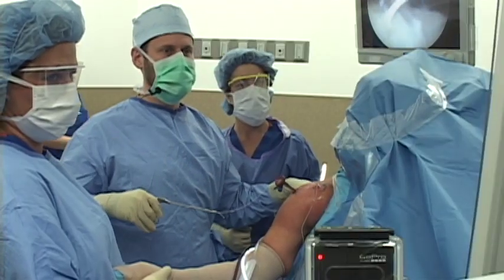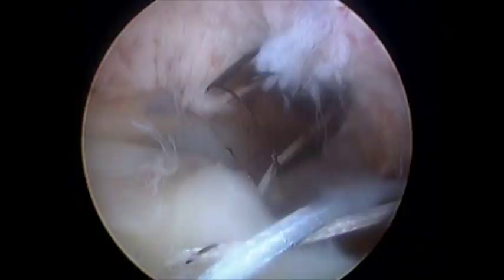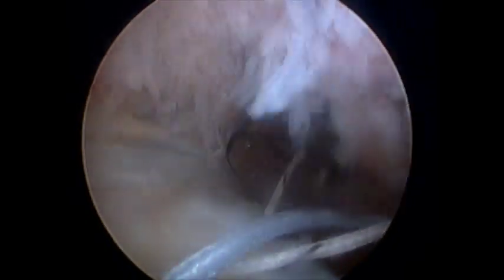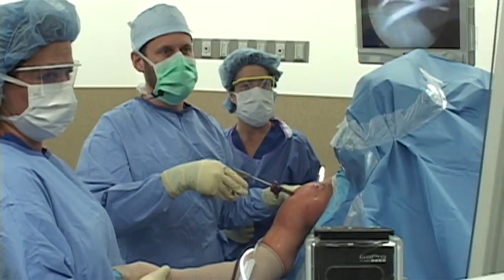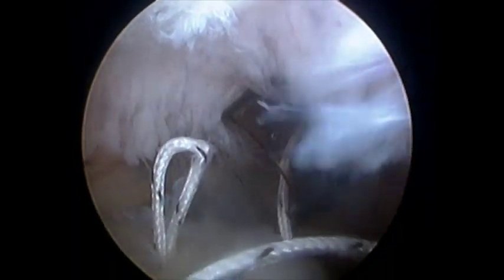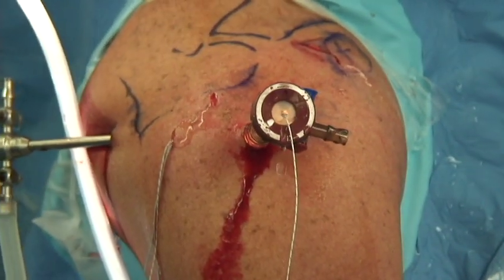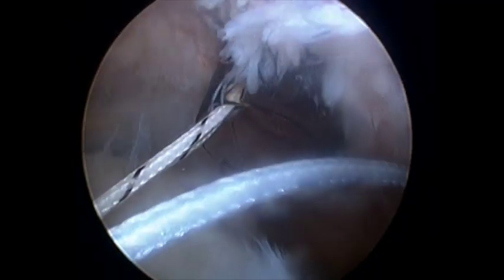Now we've got three stitches through — one, two, three — and we only need one more. We're going to park this one as well, and then we'll grab the last one to pass it through. We're going to reach down through there and pass the last stitch. Now I'll grab it and pull it out. We'll pull out its mate — the other end of that particular stitch — so now we've got two.